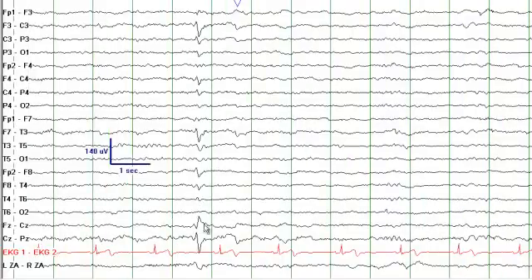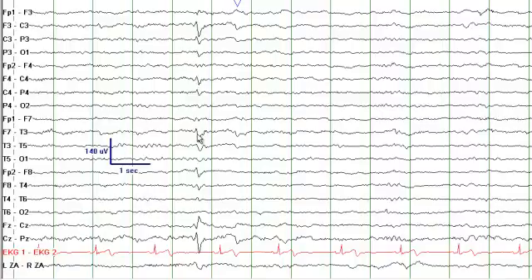You see a sharp complex in the CZ head region — you see it at CZ, and also note it at F3-C3 and F4-C4. There is some distribution involving F7 and in fact F8. There is a possibility this could be a vertex wave, which is seen in sleep.